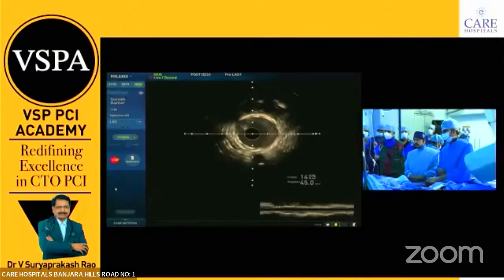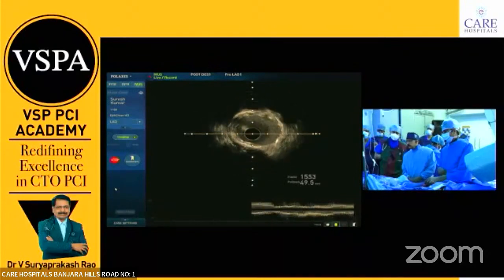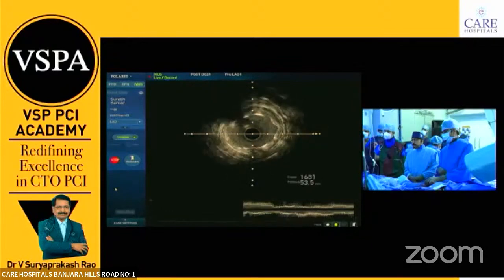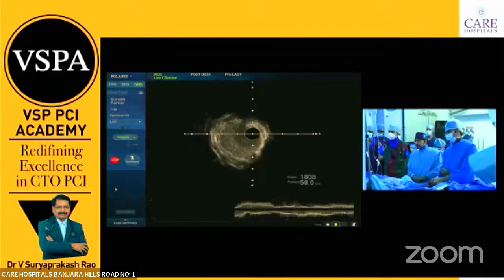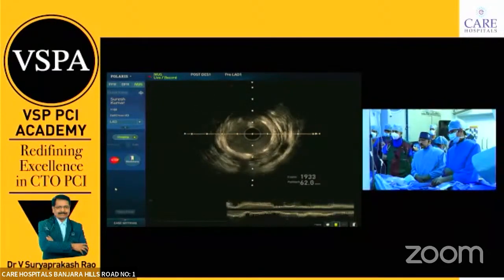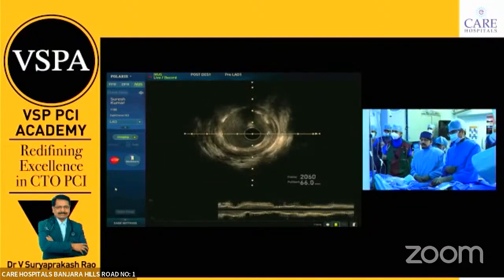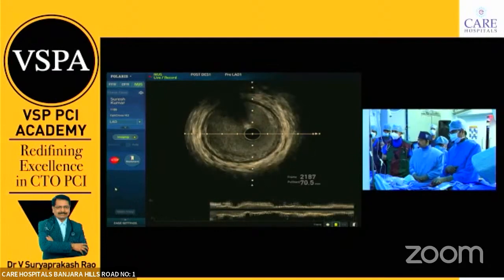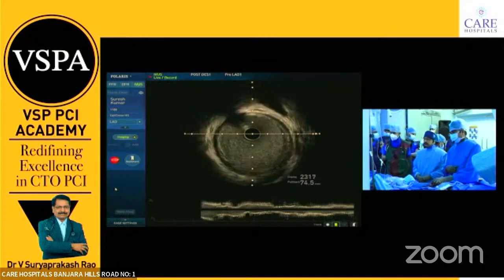The stent expansion is okay. At the ostium of the circumflex also, no struts into the circumflex. Left main appears clean, no struts in the left main.